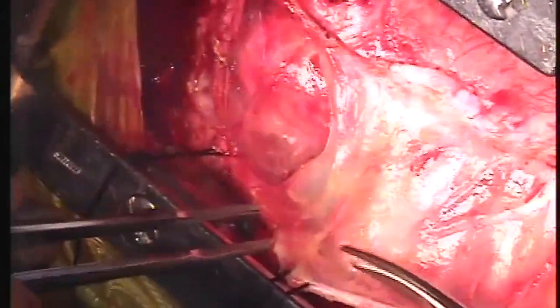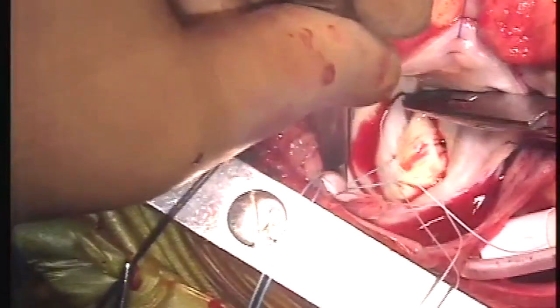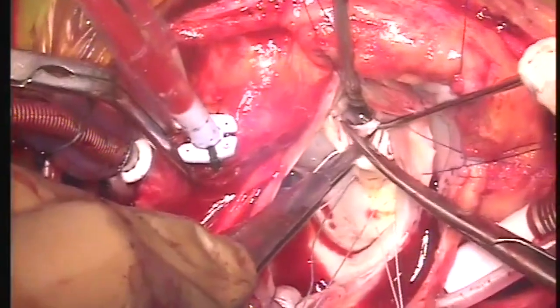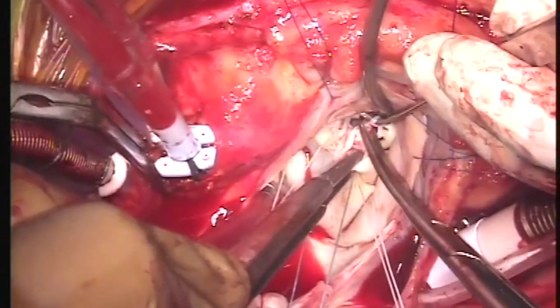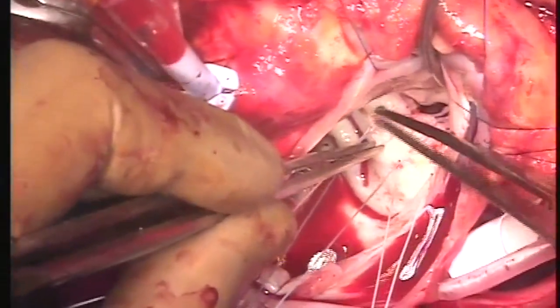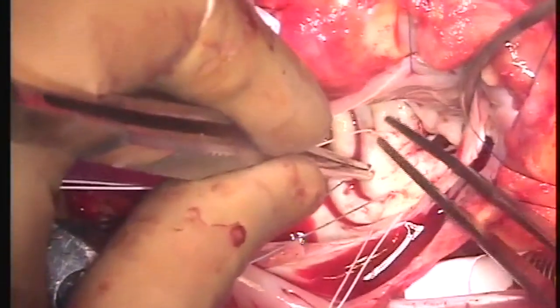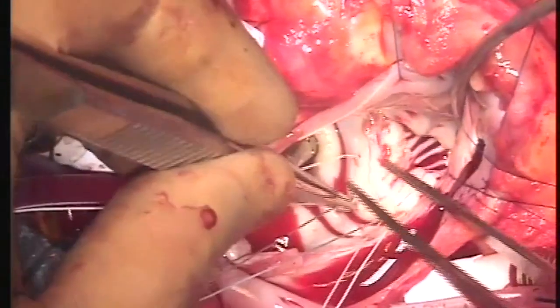Adhesiolysis was performed and then put on cardiopulmonary bypass. Mitral valve assessment is performed. Now the annuloplasty sutures are taken. All the secondary chordae which are restricting the PML are now released. Peeling of the PML is performed now. This peeling helps the PML to become more pliable.